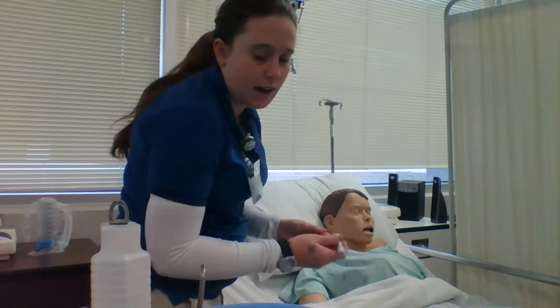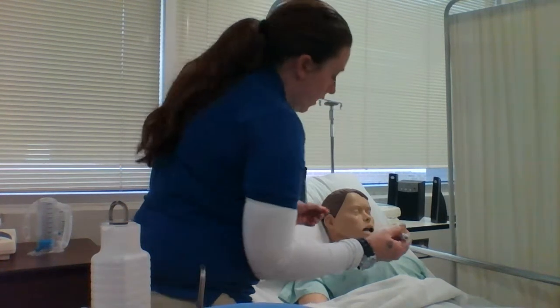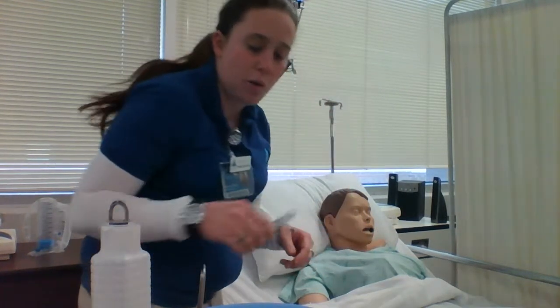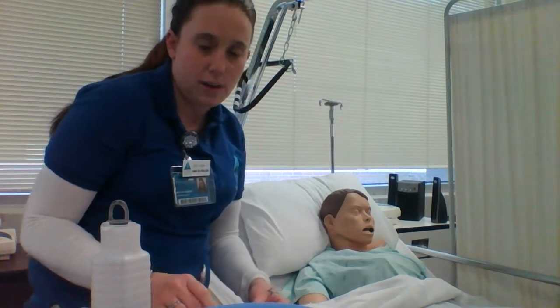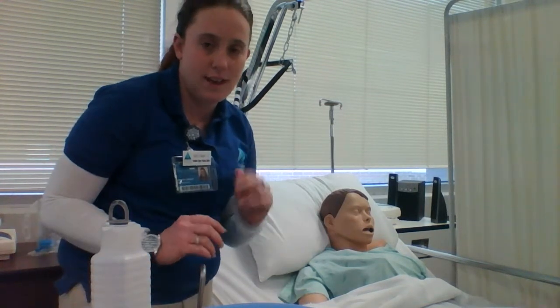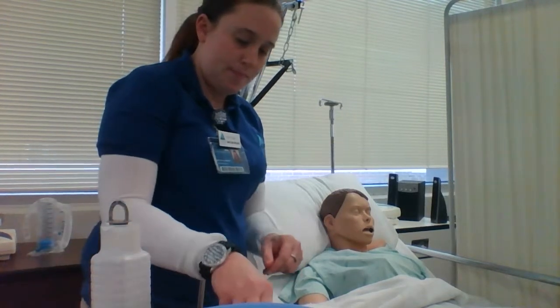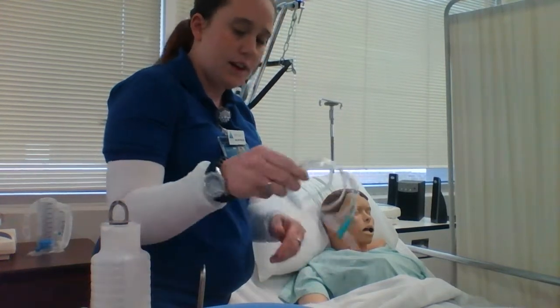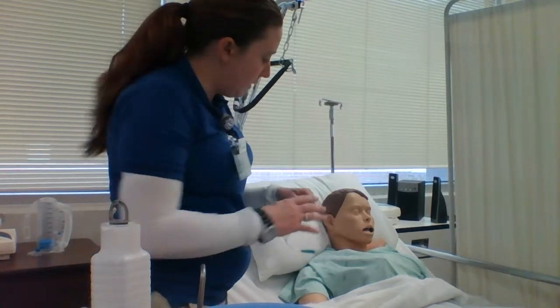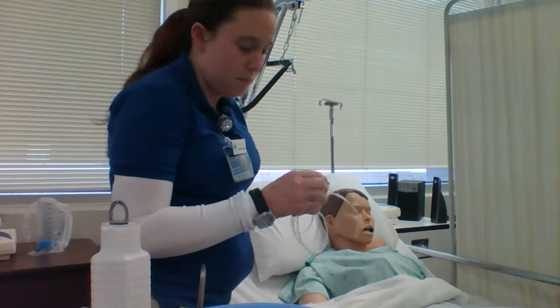The first thing that I'm going to do is look at the oral cavity as well as the nasal cavity for patency and any deviations. Okay, there are no nasal deviations, no past nasal surgeries, no bleeding, and the patient has fluid patency in both nostrils. I've decided I'm going to put it in the right nostril, and I'm going to go ahead and measure the tube.